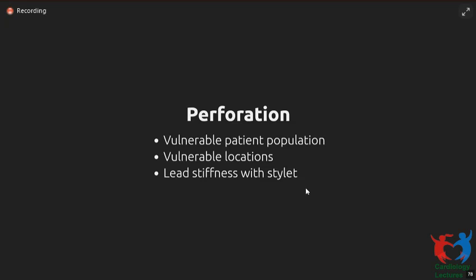But the specific locations, two specific locations I would mention are right ventricular apex, very thin part. Be always careful when you put leads in the apex. And the other is the lateral right atrium. So lateral right atrium again is very thin. There are some muscle fibers interspersed with thin areas which, if you transilluminate, you will see. You can see light coming from the other side. So very thin. When you put an active fixation lead there, you can perforate. So again, be very careful with that.